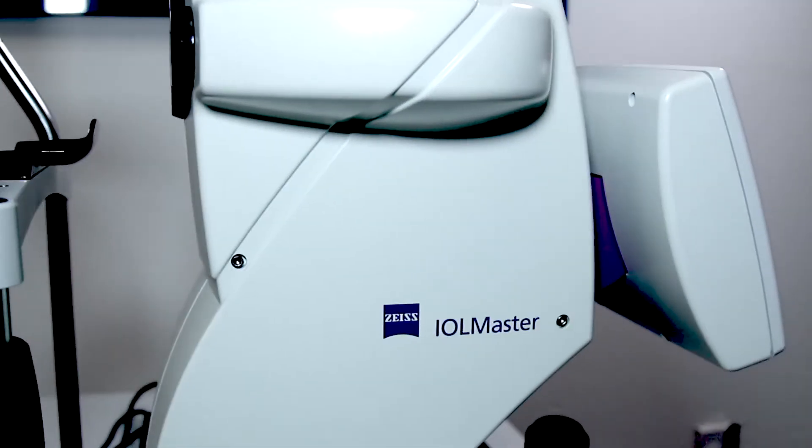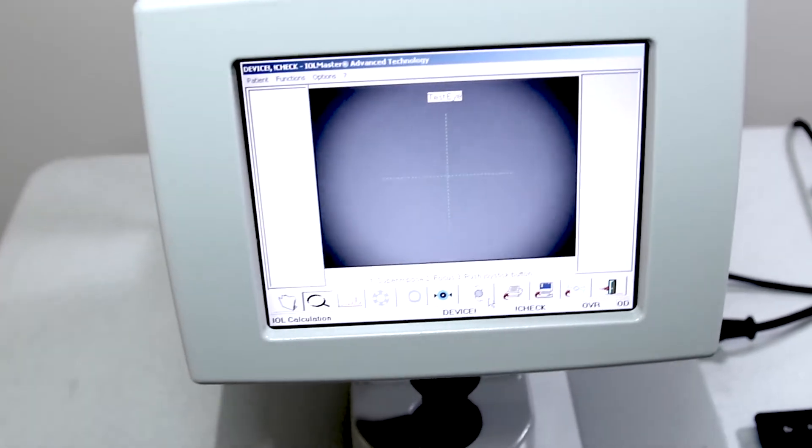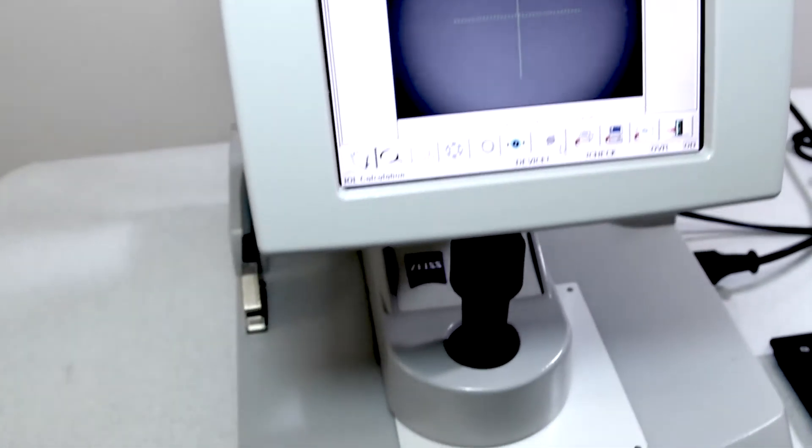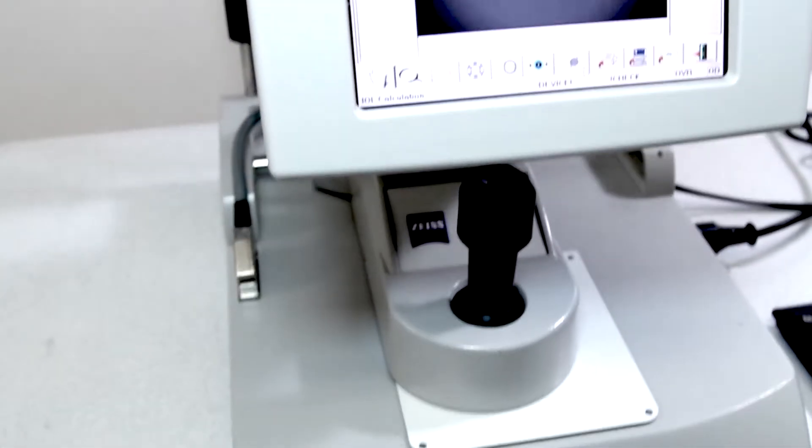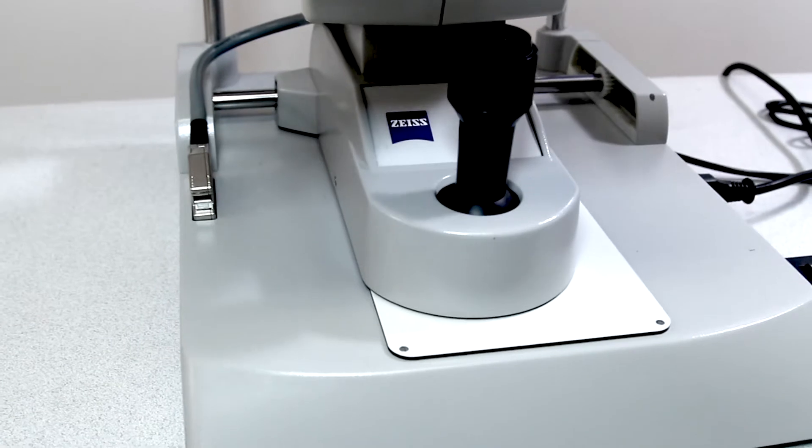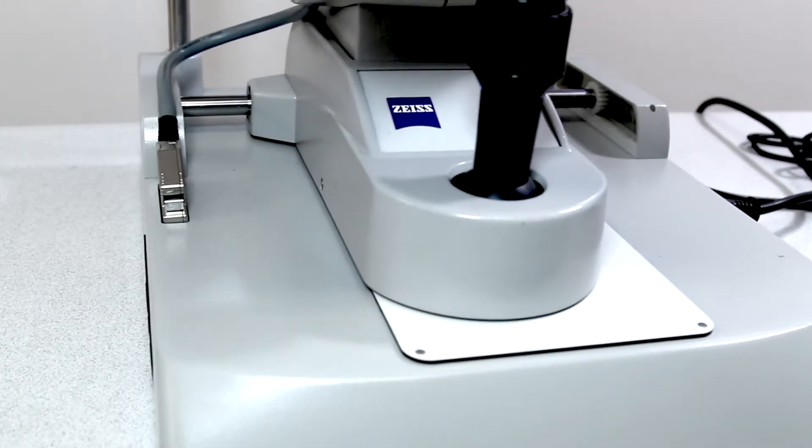Also, because the IOL Master is non-contact, nothing touches the eye itself. There is no need for anesthesia and there is no potential for spread of contamination from the equipment.